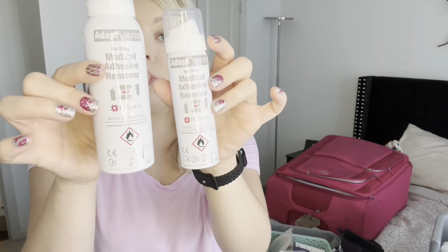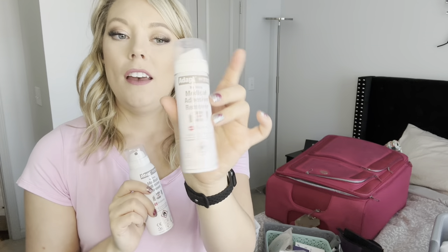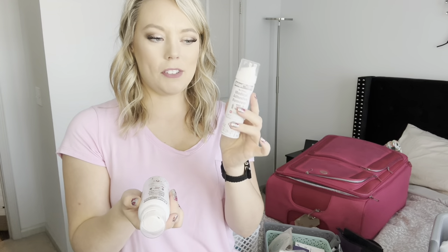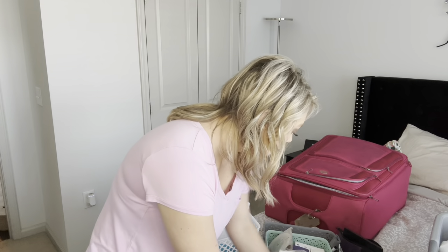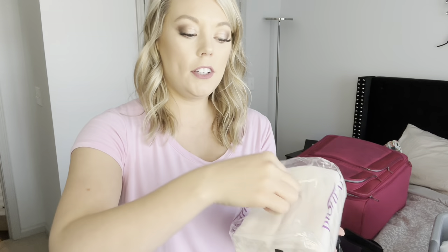When traveling, the 3.4 fluid ounce adhesive remover spray would still pass TSA, but they also come in mini sizes which is what I typically travel with. This one is almost empty so I need to reorder it. I'm going to take this brand new full one — I like to have backups with everything because nothing is worse than running out of something you use every day.